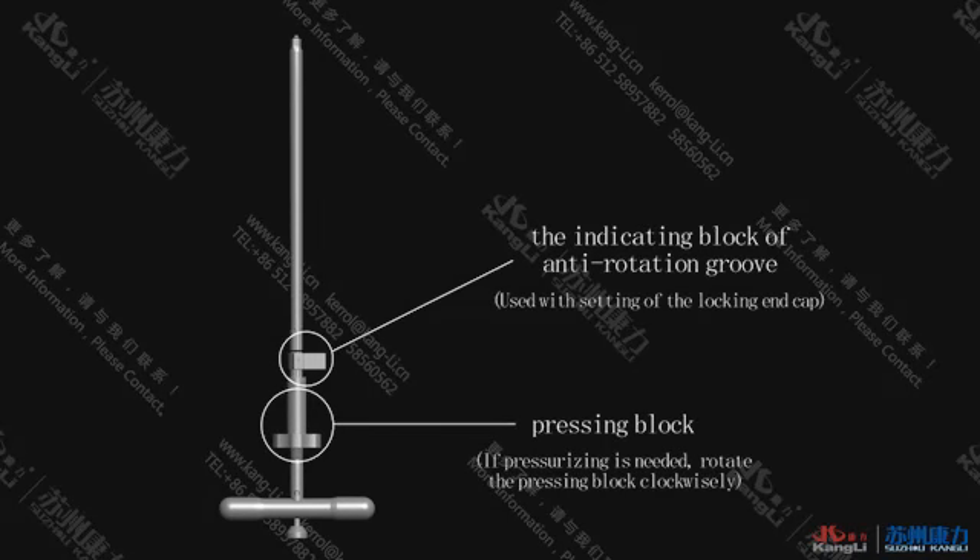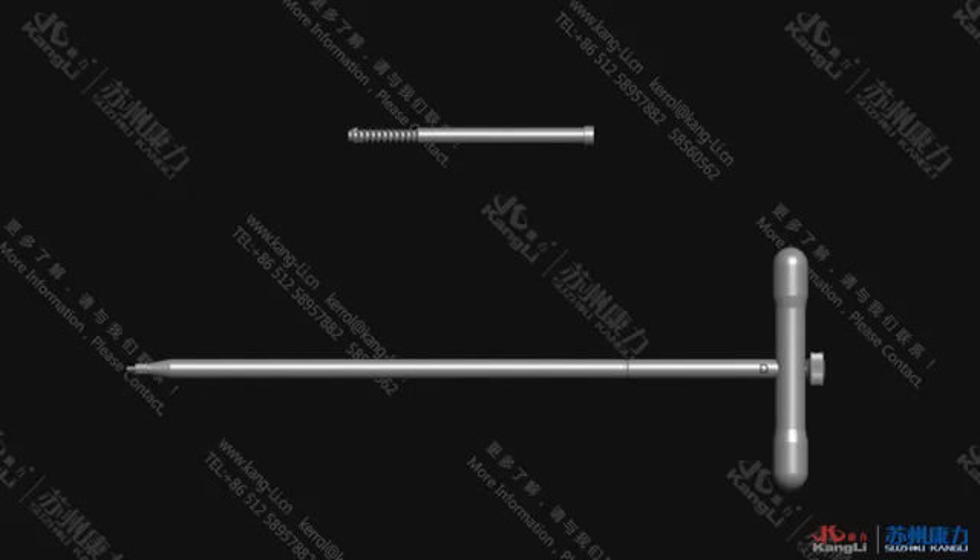Check the placement with fluoroscopy and note the anti-rotating groove. If compression is needed, rotate the pressing block clockwise. In order to improve stability, an anti-rotation screw can be installed.